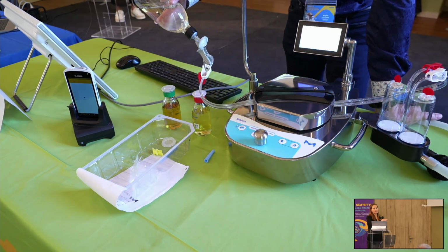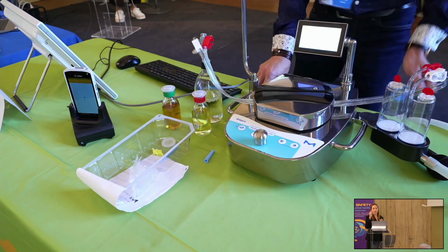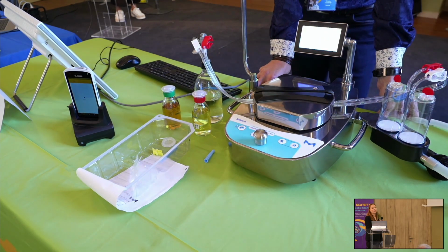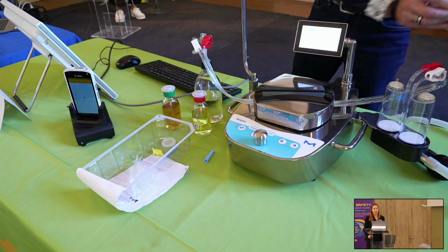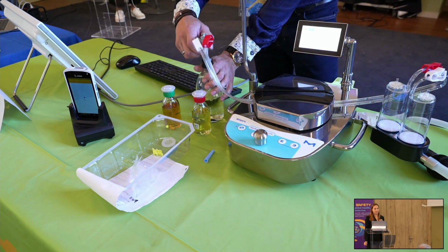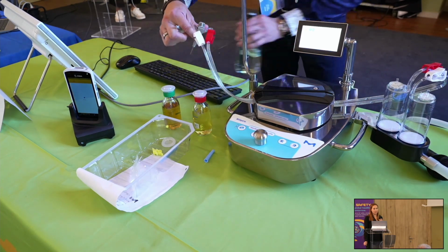We will use the sterility test knob to change from one step to the next. When we have finished one step, we can see the instructions of the next step on the screen of the sterility test by pressing the sterility test knob. Now the rinsing fluid has been filtered.